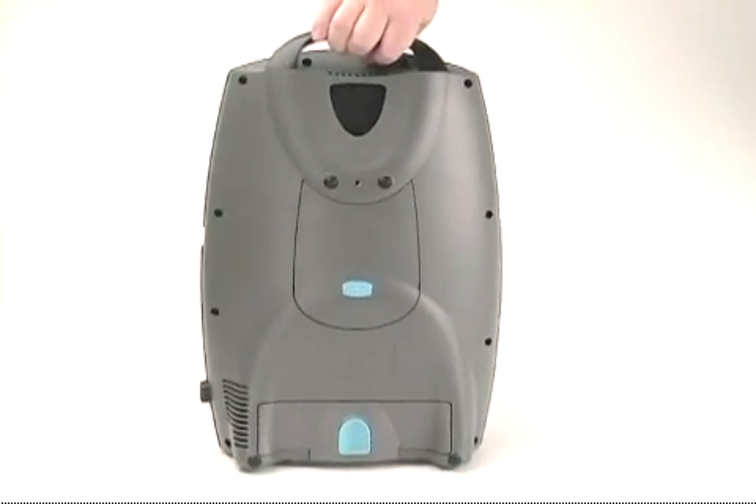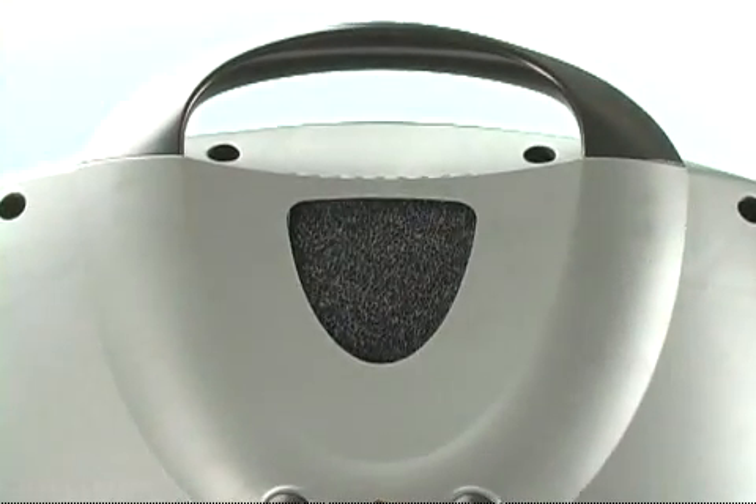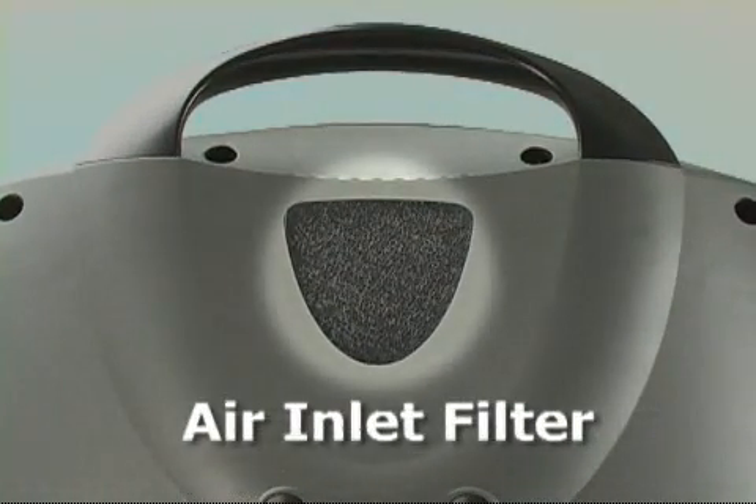You should also clean the air inlet filter frequently. The air inlet filter on your Eclipse II removes impurities from the ambient air that it draws in, helping extend the life of the device. Check the air inlet filter daily and clean it at least once a week.